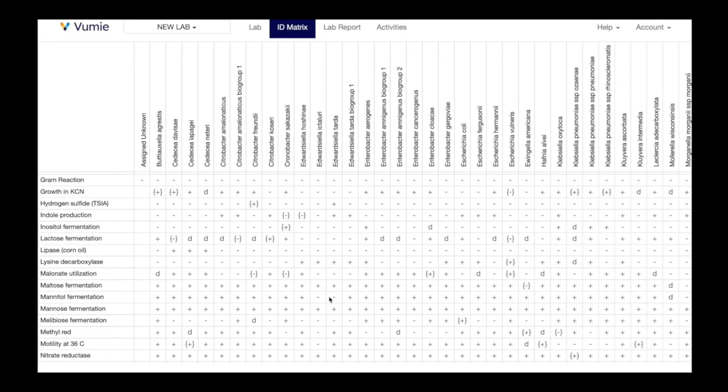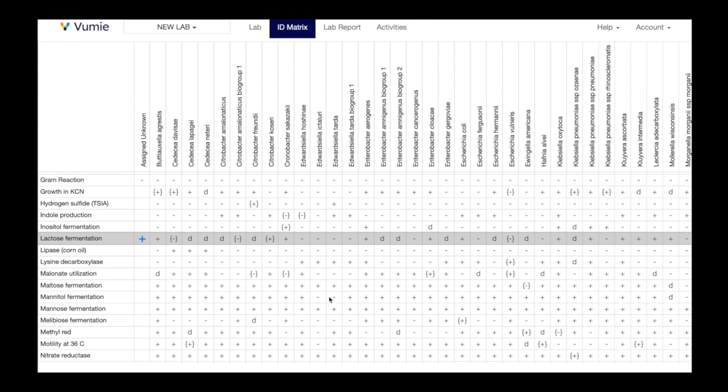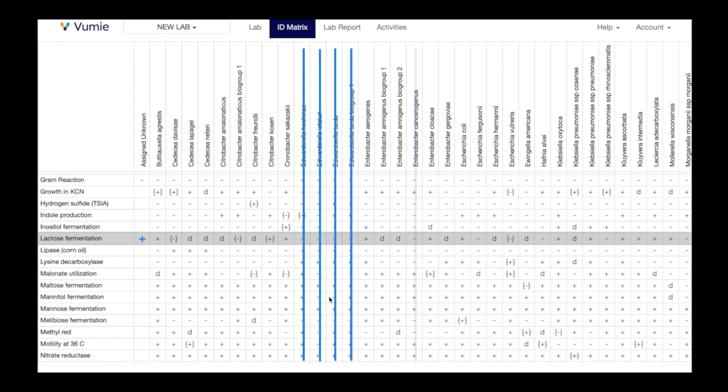In the ID matrix, the only results that cause a microbe to be eliminated as a potential ID are those that are completely opposite from the entered test result. If you enter a result of positive for a test, all species with a result of negative for that test are eliminated.